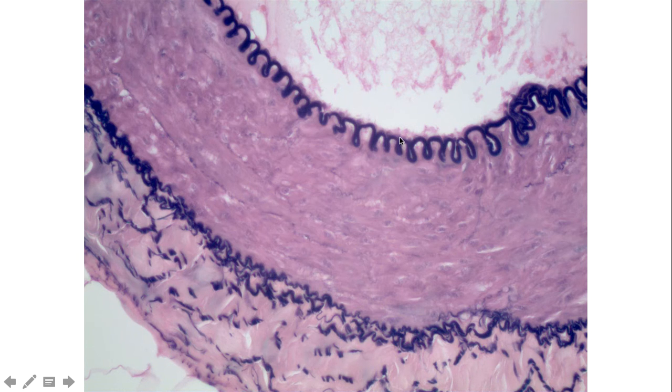The tunica interna or tunica intima is actually going to be inside that. And so this very thin pink layer that's just inside the purple line, this is going to be the tunica interna. This very, very nice, darkly stained elastic layer, this is going to be a nice characteristic of those muscular arteries.